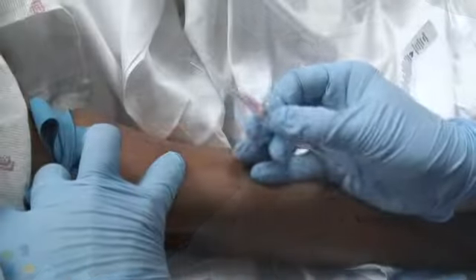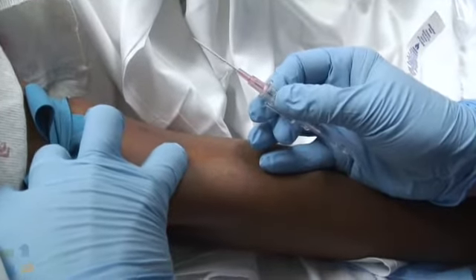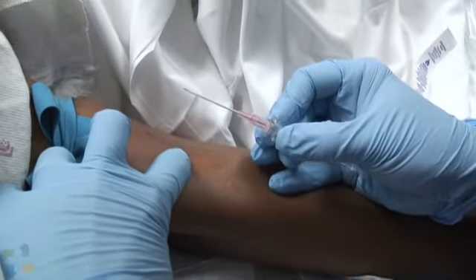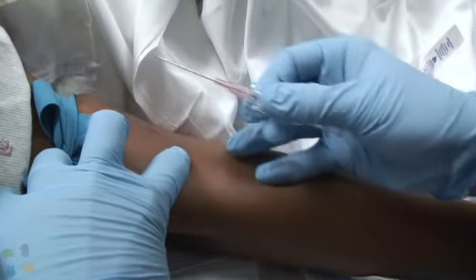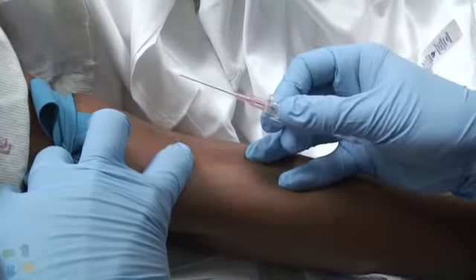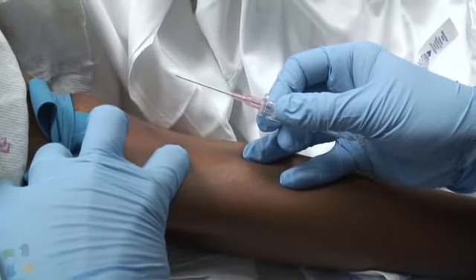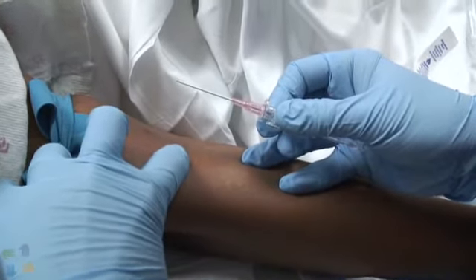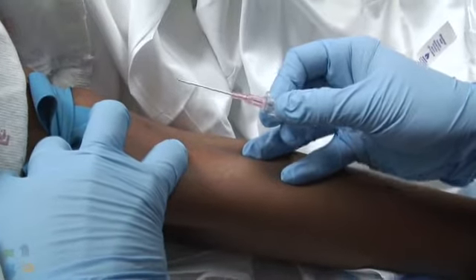Using universal precautions, palpate with your index finger of your non-dominant hand along the anterior arm. Veins should feel soft, elastic, resilient, and should be pulseless.